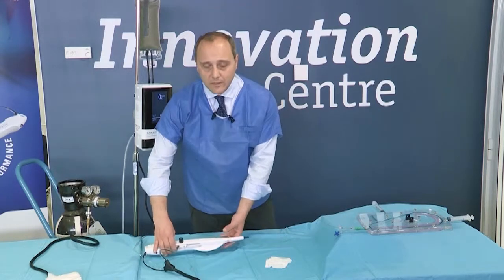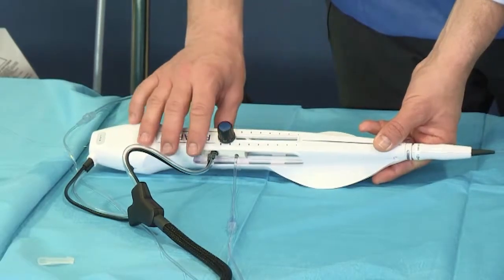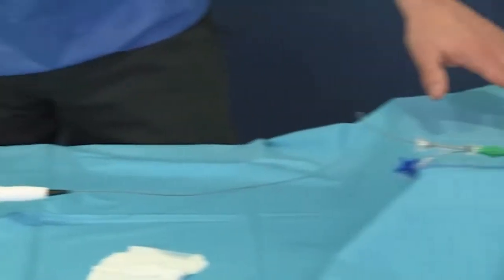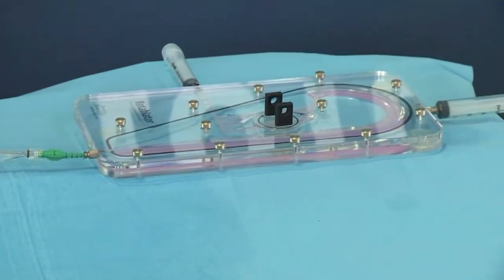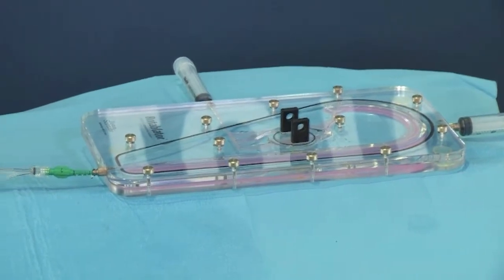Let's do another run of rotablation within the coronary artery. Everything is ready. Our bar is within the plastic model. Let's just focus on the plastic model now. Activate rotablation mode.